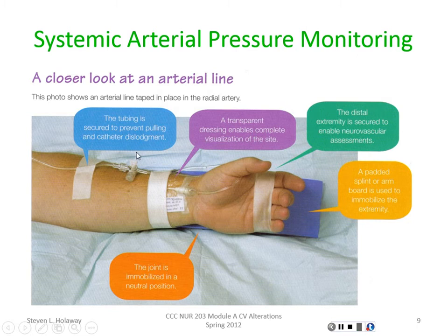You always have to make sure that stopcock is turned to the right direction. You want to make sure it's turned off to the actual drawing port. If you basically turn that stopcock back toward the patient, that would actually allow blood to come from that arterial line and come out. So if you left that open in the wrong direction, that patient could bleed out from that.